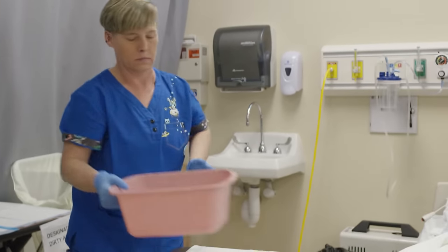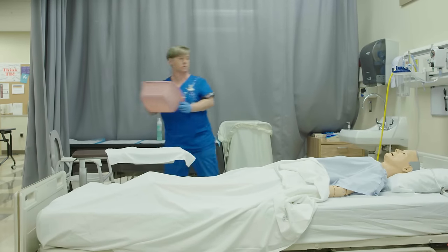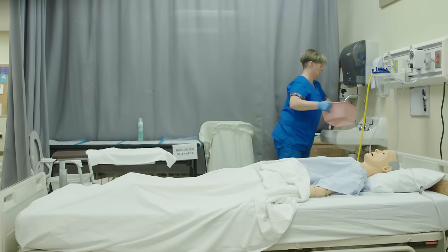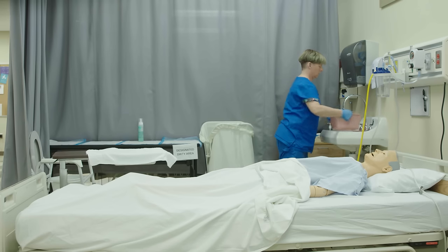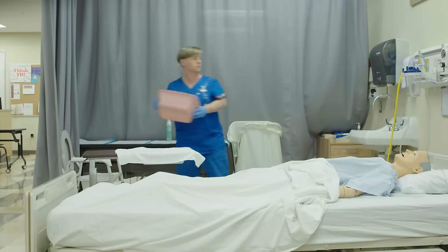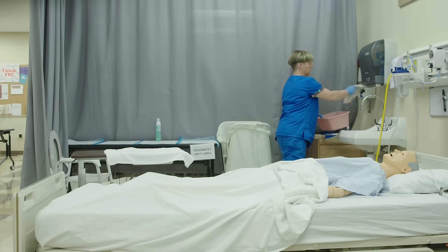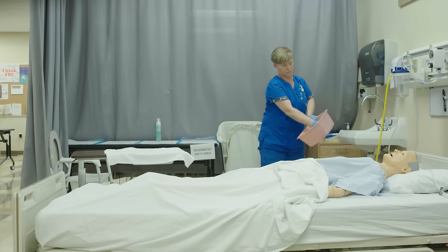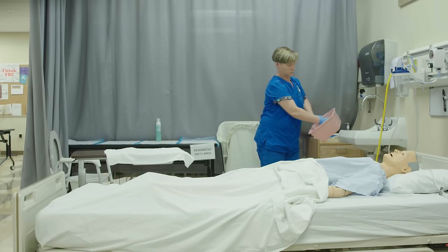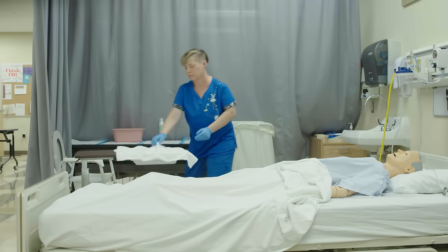The wash basin is then emptied, with the contents going into the bedside commode toilet. The wash basin is then rinsed, with the contents going into the toilet or bedside commode. The basin is then dried. After rinsing and drying basin, the basin is placed in the designated dirty supply area.